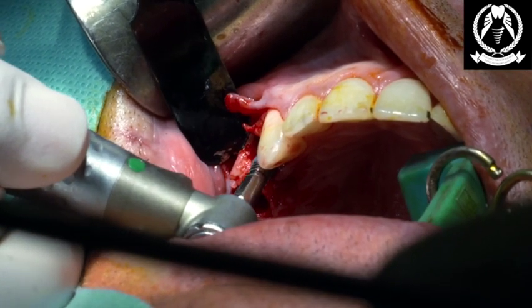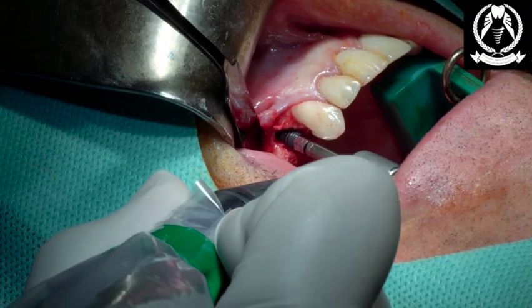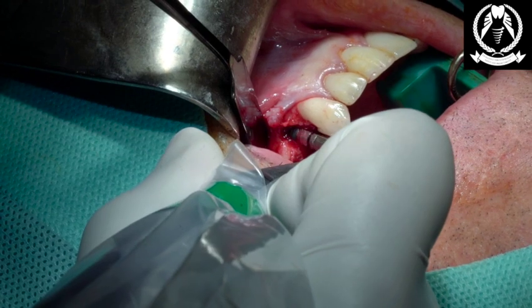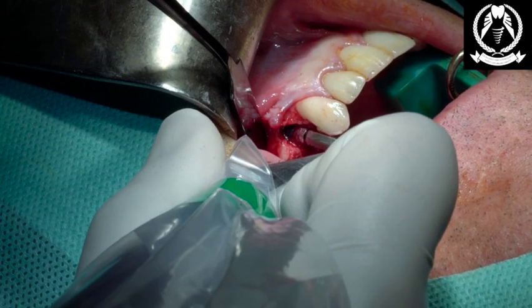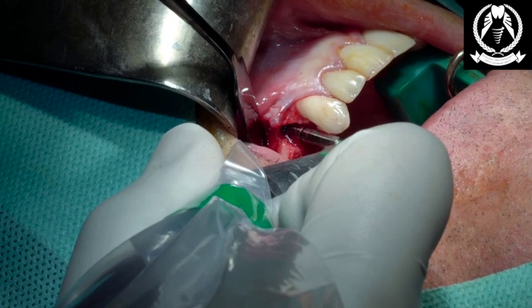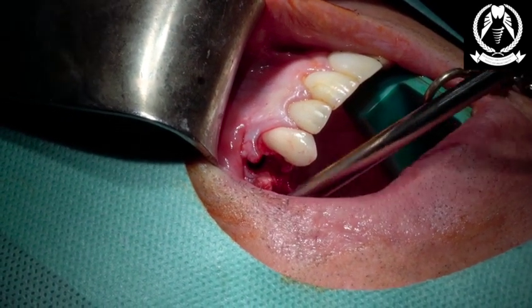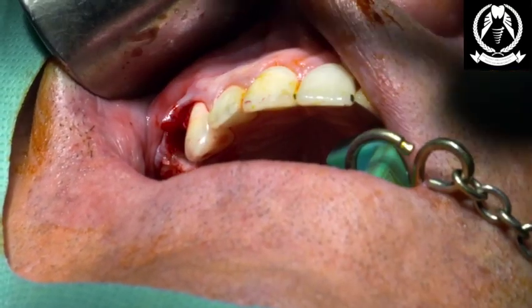You can see there the numbers: 3, nice, 4, now 7, 8, 12, 13, okay, well done, 19, great, 21, 25, 29, 32, 35, 44, 47, 49. Indicated torque at 52 Newton centimeters. So the clinical evidence shows us that any torque over 24 is acceptable for immediate loading. We are smoking at 47.